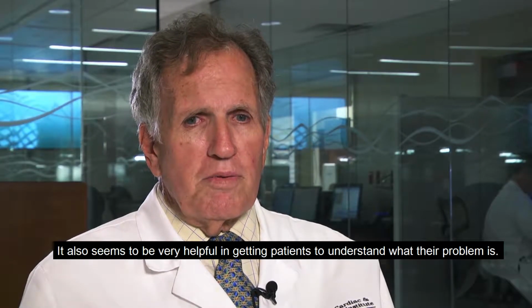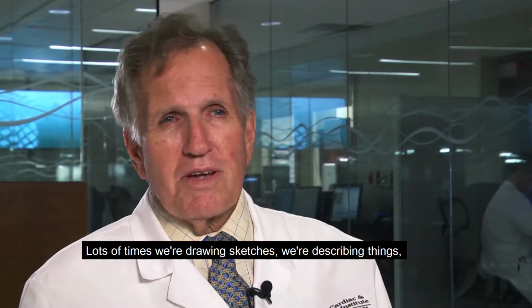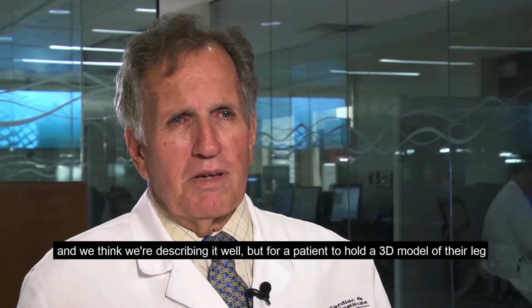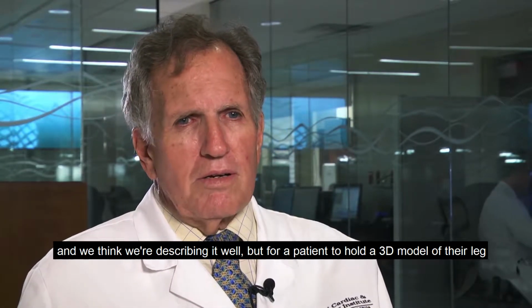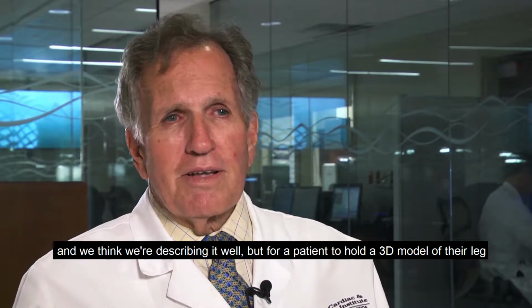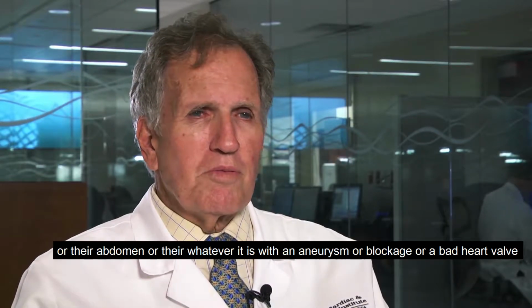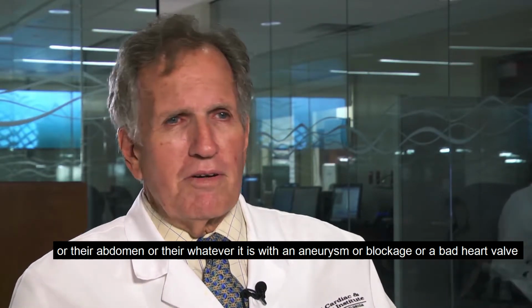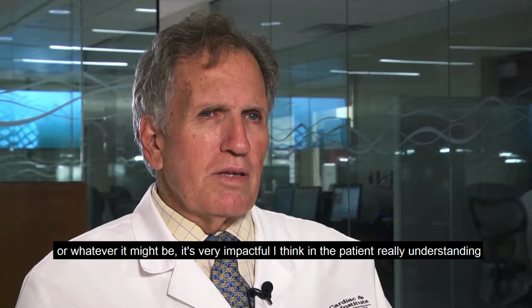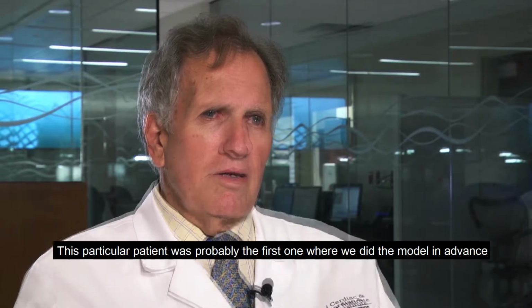It also seems to be very helpful in getting patients to understand what their problem is. Lots of times we're drawing sketches, we're describing things, and we think we're describing it well, but for a patient to hold a three-dimensional model of their leg or their abdomen or their whatever it is, with an aneurysm or a blockage or a bad heart valve or whatever it might be, is very impactful, I think, in the patient really understanding what their problem is and why they need to be treated.